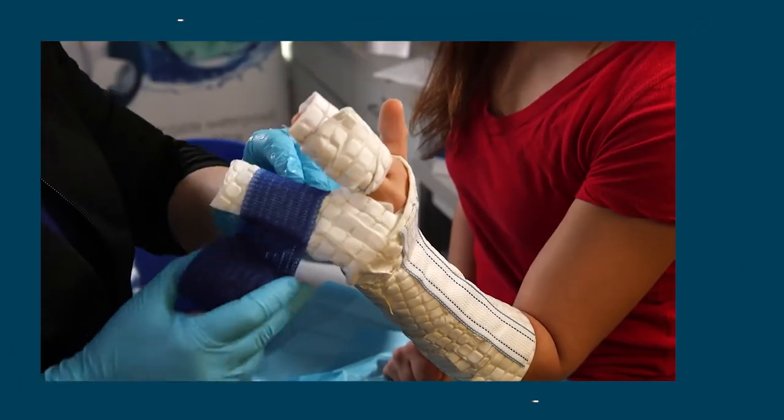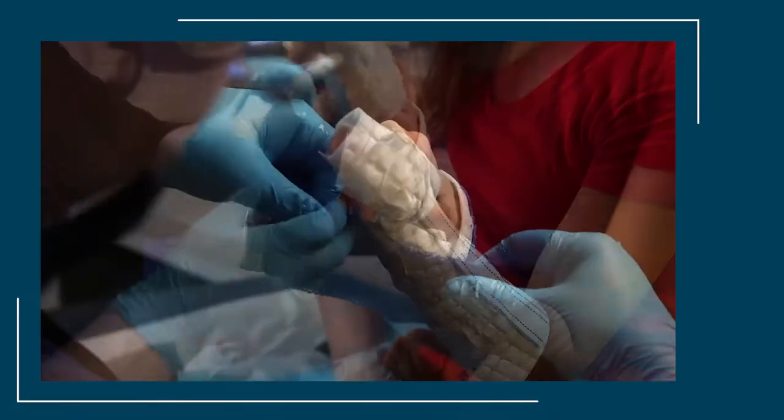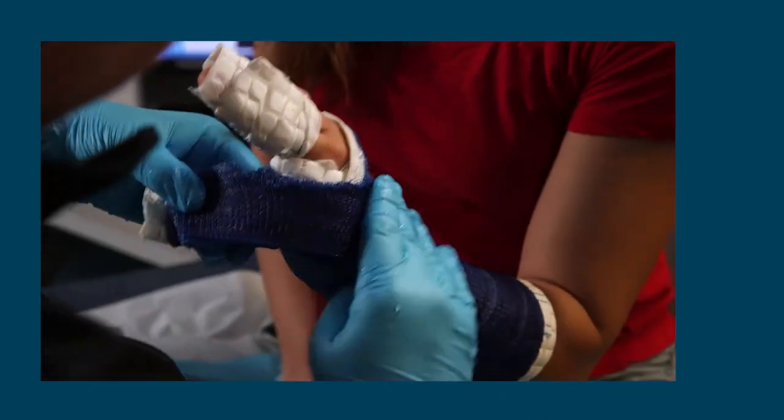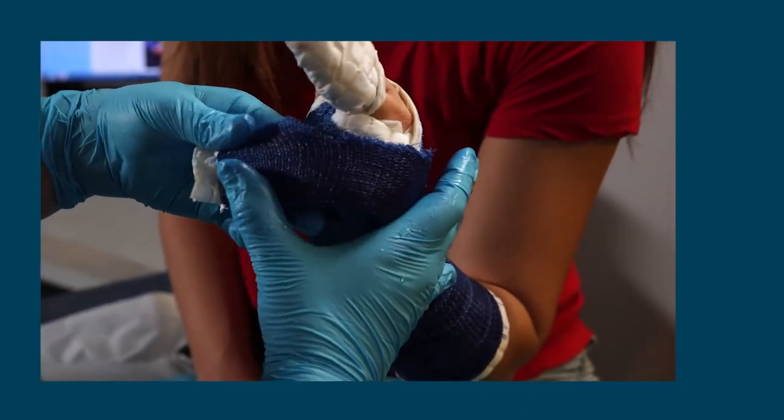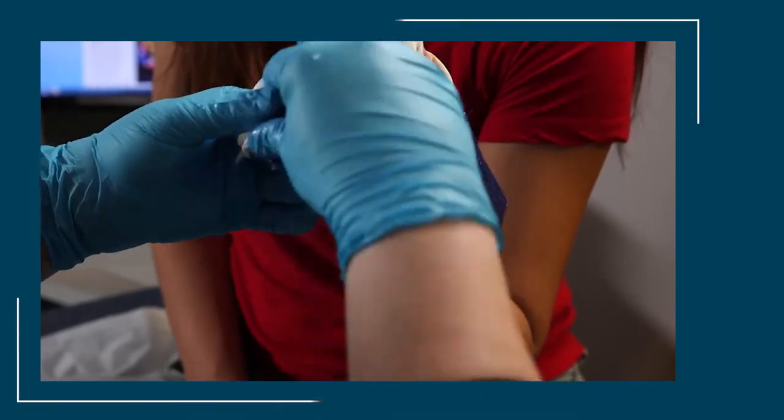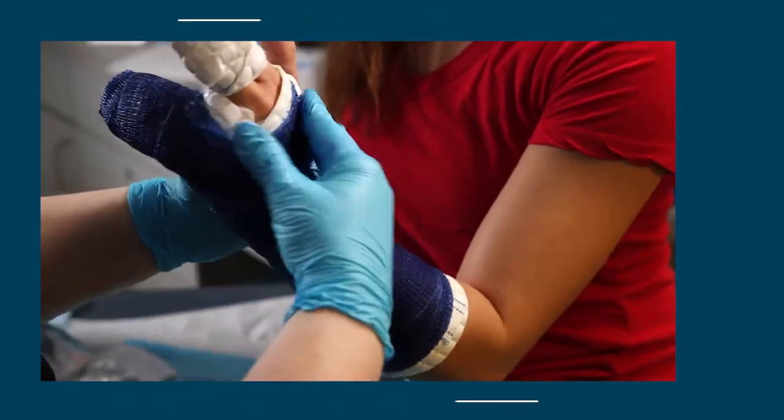Apply the fiberglass. There are many techniques for applying fiberglass. Use the application method you prefer. Apply the appropriate mold.